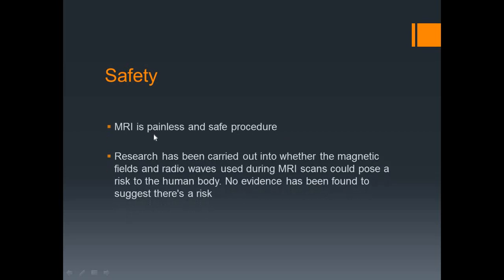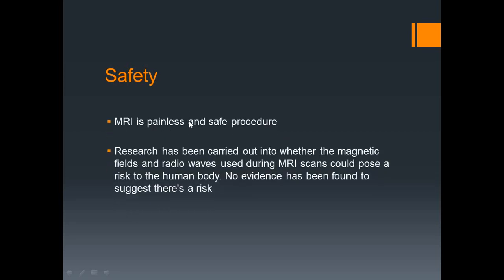Safety. MRI is a painless and safe procedure. Yes, because it is a non-invasive device, it doesn't need to penetrate our body, so that's why it's painless. Research has been carried out into whether the magnetic fields and radio waves used during MRI scans could pose a risk to the human body. No evidence has been found to suggest there is a risk. So there is no risk of magnetism and radio waves for the body.